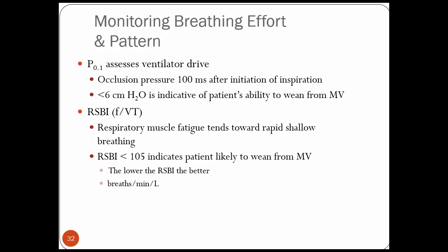This is part 2 of monitoring the patient in ICU. We're going to pick up with monitoring breathing effort and pattern. The P0.1 is a type of weaning parameter that assesses ventilatory drive. This is the occlusion pressure 100 milliseconds after initiation of inspiration.